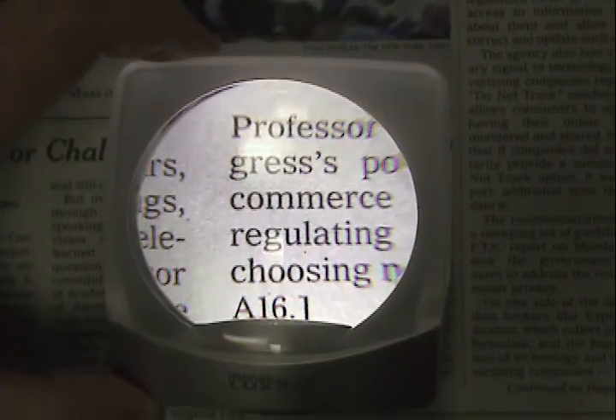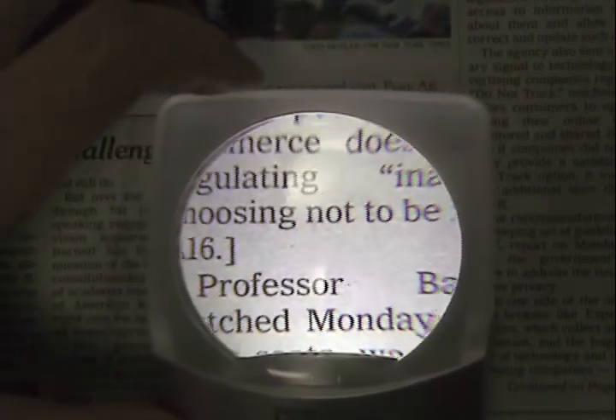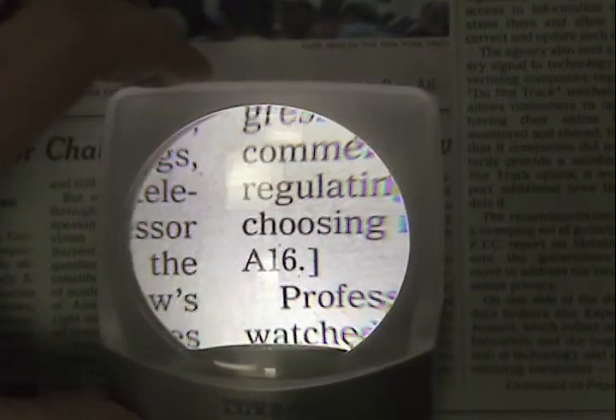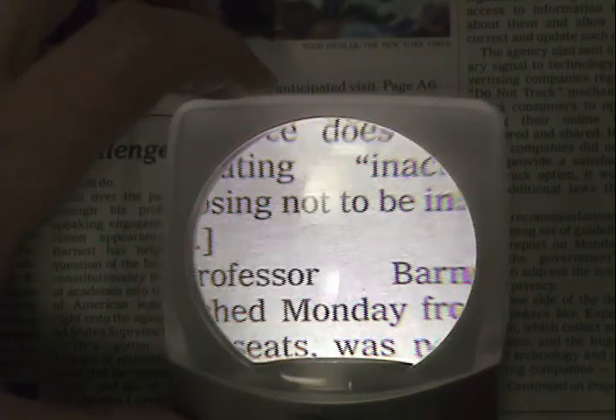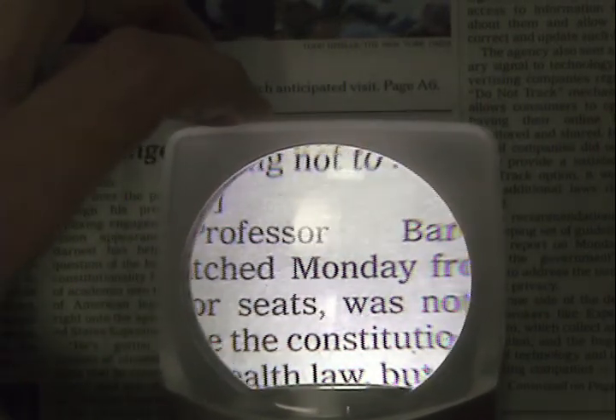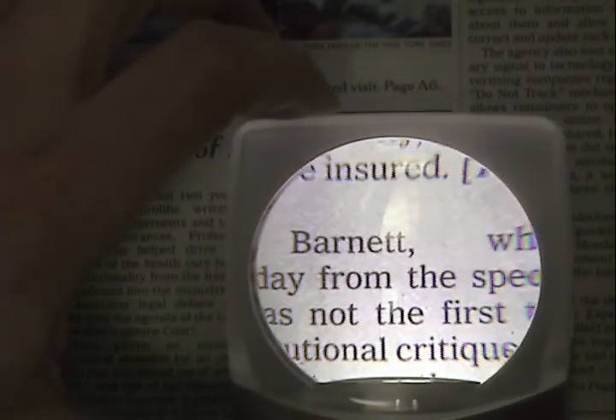Users will benefit by being able to see text magnified three times without having to bend over to get their eyes close to the lens. This makes it easier and more comfortable to use than comparable magnifiers. And since it rests on the page and glides easily across it, those with tremors or with little hand strength can use it with ease.